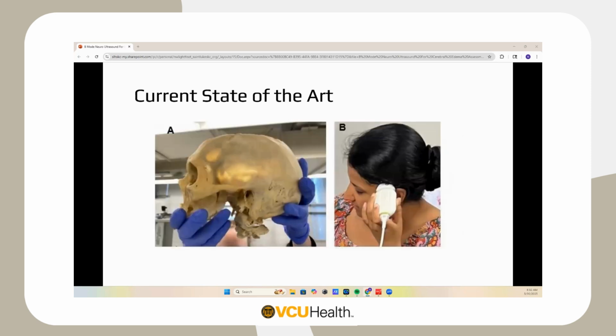So very basic here in figure A, you can see the thin portion of the temporal bone called the squamous portion. To get B mode ultrasound images, this is the area through which you insonate, but the real trick here is to use a low frequency phased array probe at 1 to 3 megahertz, either at the transcranial preset, if your machine has it, or the abdominal preset.